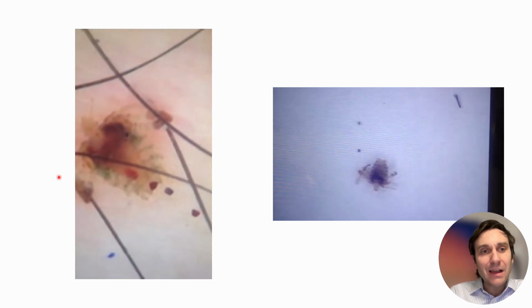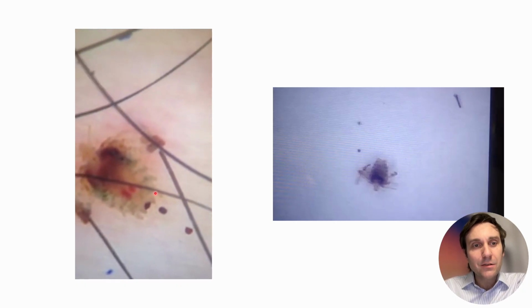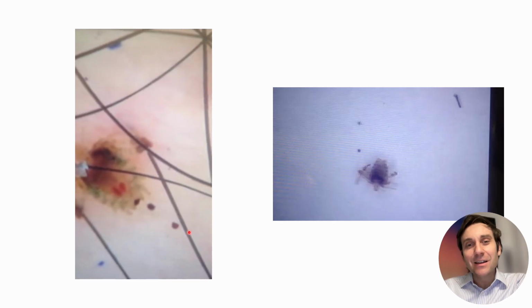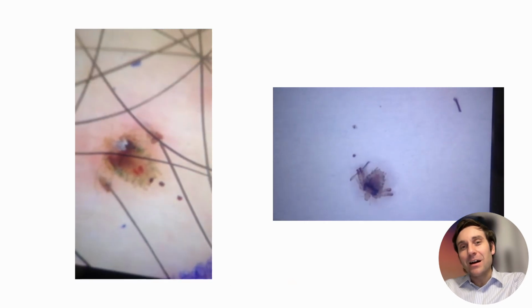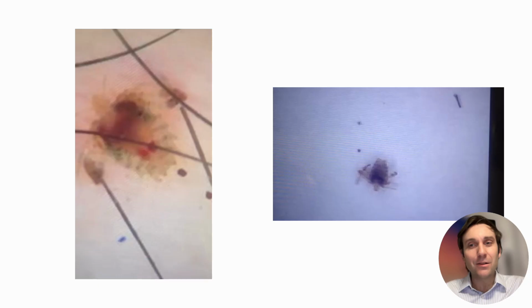You see the crab lice. You see the crab lice eating. And you see crab lice coming here. It's pooing, right? Doing the digestion here. And it's coming here. And you can see this guy, whenever you took it out of the body, trying to hold here to anything around, fighting for his life. So easy with dermoscopy, right?